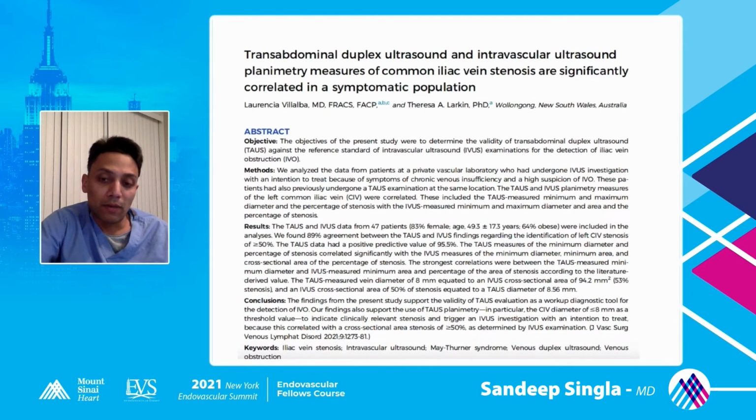Now, as for the role of duplex, when we manage these patients, if a patient has significant compression and we need to follow this patient for any restenosis, we are not going to perform repeat CT venograms and intravascular ultrasound. So it is important to know how a duplex ultrasound will perform in comparison to IVUS. There is recent data coming out which shows a good positive correlation, and more studies are needed on how to follow up these patients after stenting and what numbers need to be used on duplex ultrasound.